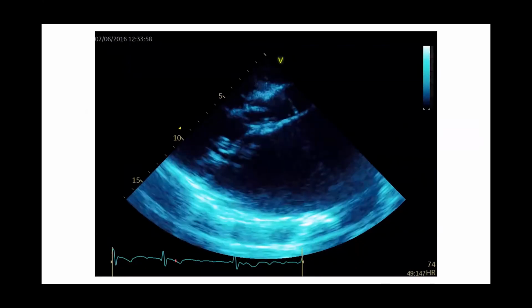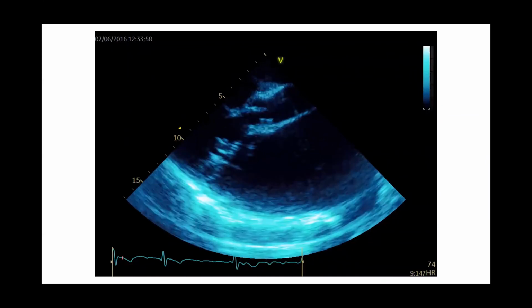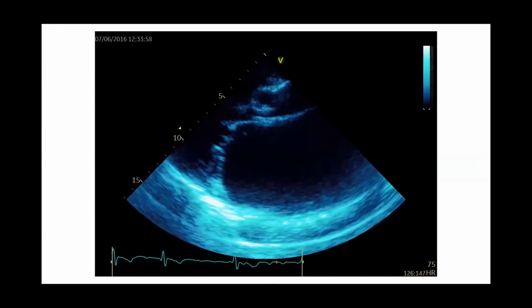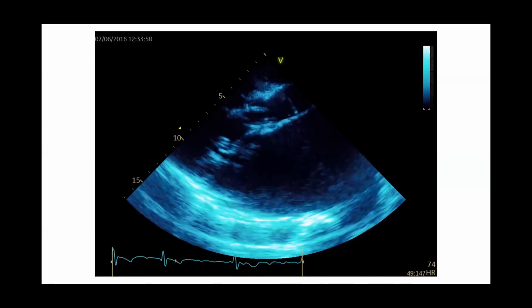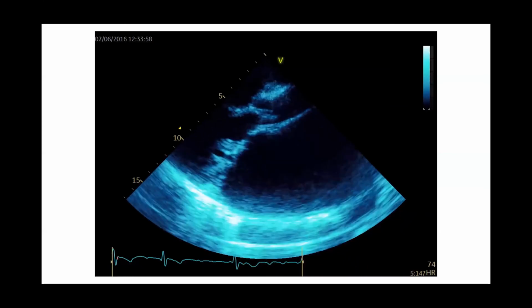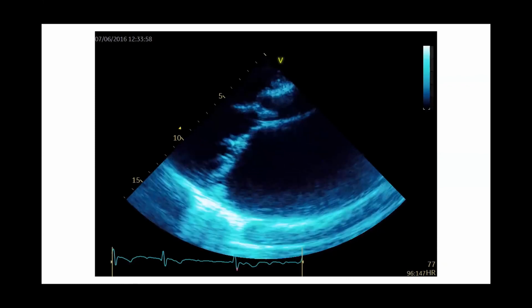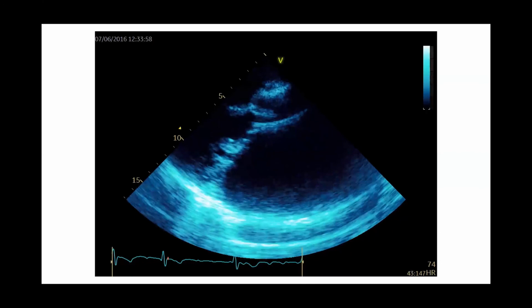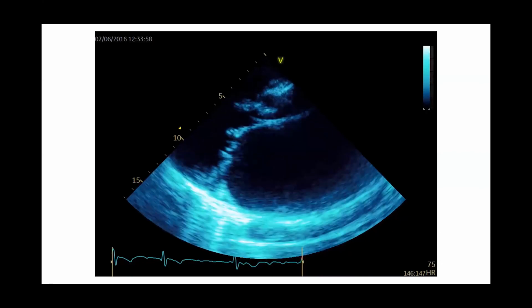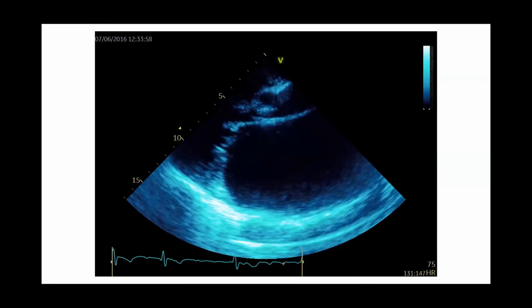Wow. So yeah, parasternal long axis view, we can hardly see the RVOT in this image. The ascending aorta looks normal in size and I've got a massively dilated left atrium. In regards to heart rate and rhythm, probably AF at a rate of 74 to 77.